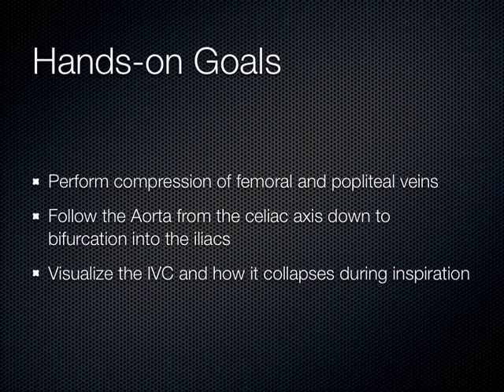Use it as kind of a free scanning session to tighten up wherever else you have questions, heart, whatever it is you want to do. But really today, it's the DVT, aorta, and IVC.